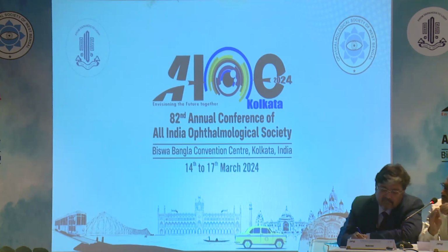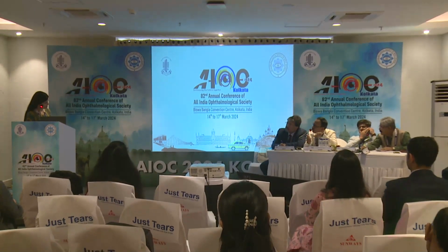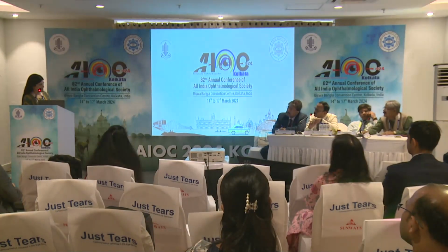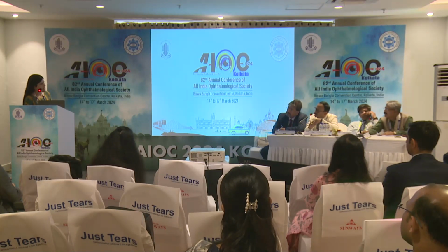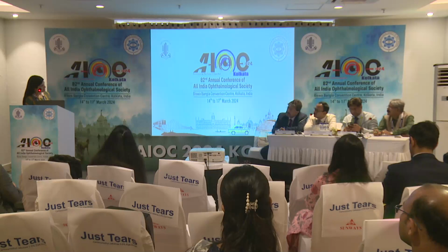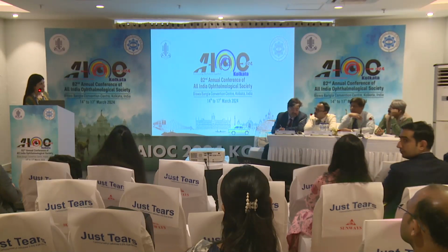I just wanted to check, do you have any specific criteria where you do this intracapsular implantation and where you decide about putting a scleral fixating intraocular lens? So if the zonules are partly intact, in which case mostly they are in the initial phases, we try to preserve the posterior capsule. If the posterior capsule is preserved, so many inherent future complications are prevented. If the vitreous is not in the pupillary area, we try to manage. In the other eye of the same patient, we tried with the CTS, but it was not possible. The vitreous was coming, so we had to convert and put a transscleral fixated IOL in the other eye. But the vision was 6/6 in both the eyes.